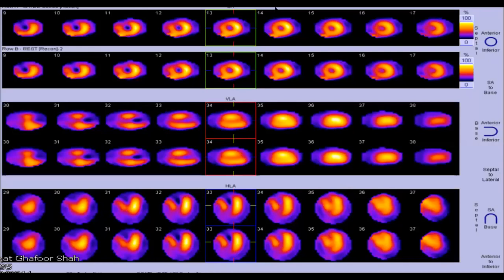Umesh is saying small size fixed perfusion defect of apical and apical septal segments. Apical septal, what is that? I didn't mention apical septal.